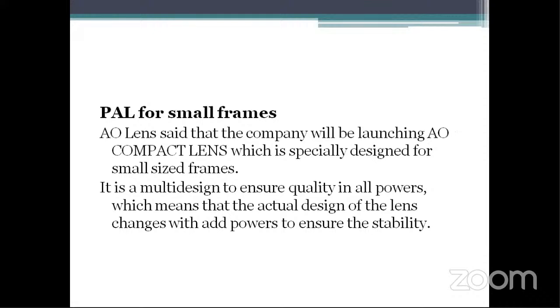Next, we have PALs for small frames. Lens companies recently launched their compact lenses, which are specially designed for small frames. So some people like using small frames, or some people do not like wearing huge spectacles, but still they are presbyopes. So such patients always prefer going with small frames. So for such patients, it is a multi-design.